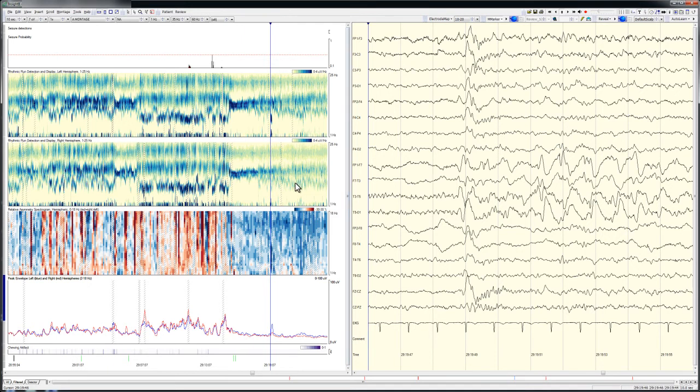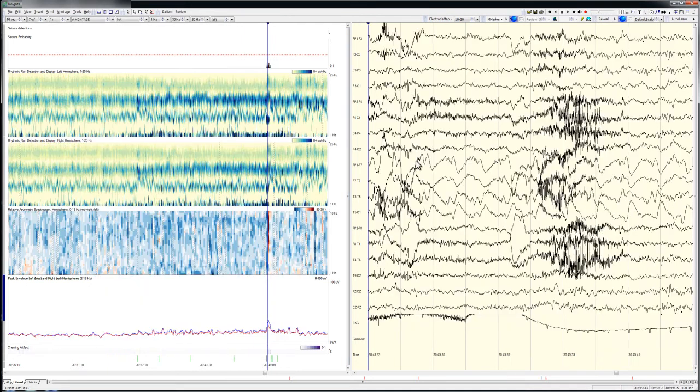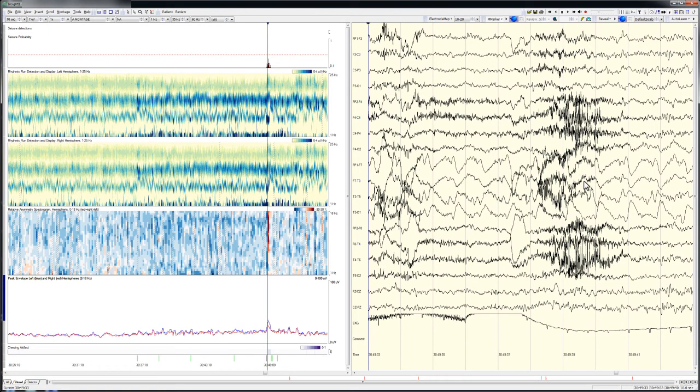My complete review of the EEG trend graphs for this 38 hour recording required about 6 minutes. Thus, over the course of a total of about 8 minutes I have been able to identify 5 seizures using the seizure detector output alone, and 2 additional electrographically subtle seizures of a different type by reviewing the EEG trending graphs.